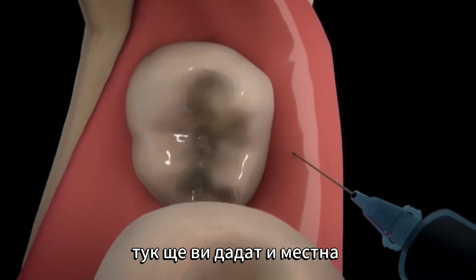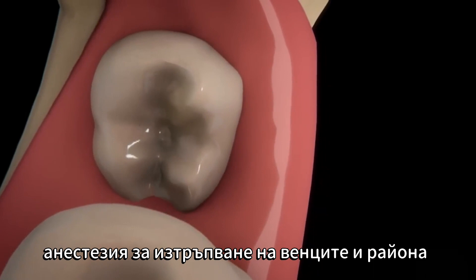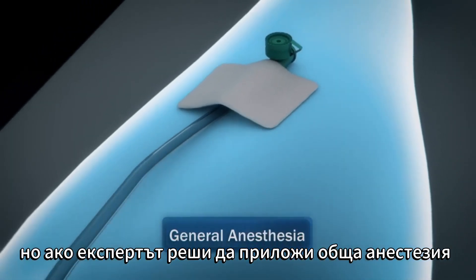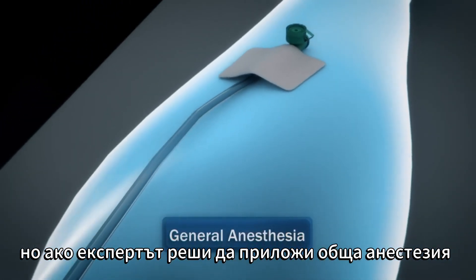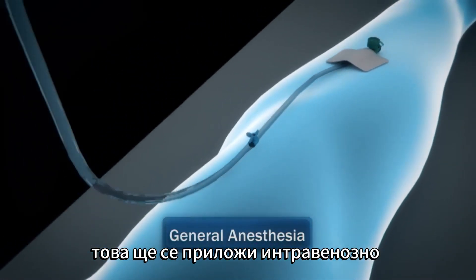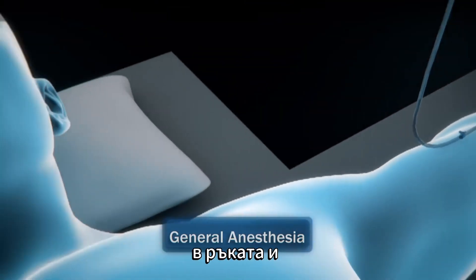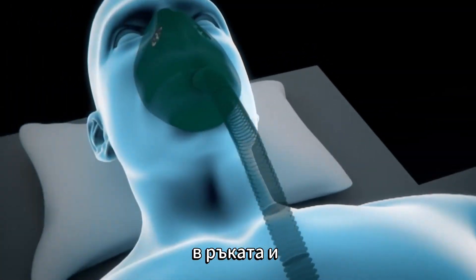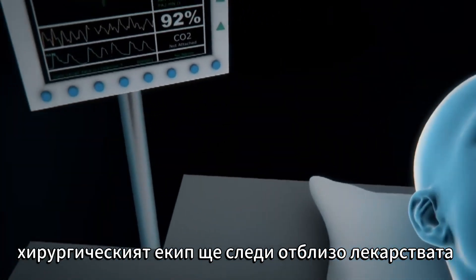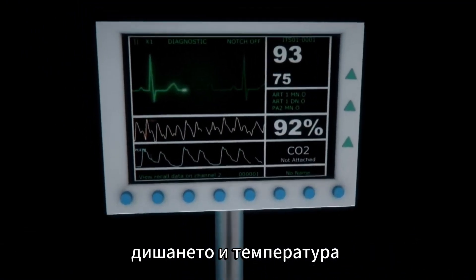Here the patient will also be given local anesthesia to numb the gums. But if the expert decides to apply general anesthesia, this will be administered through an intravenous line in the arm and the surgical team will closely monitor the medication, breathing and temperature.